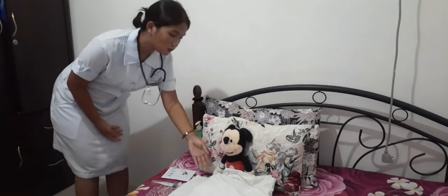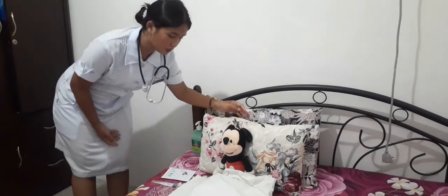So in this procedure, you need to place your patient in a sitting position or high Fowler's position. So now my patient is in sitting position. So, if your patient is using a volume-oriented spirometer, set the indicator at the target volume level. Rationale for this is that the patient will know the target volume level and avoid confusion or error.